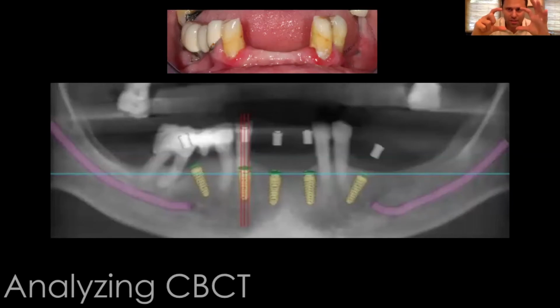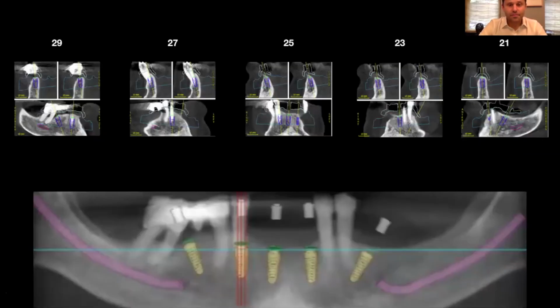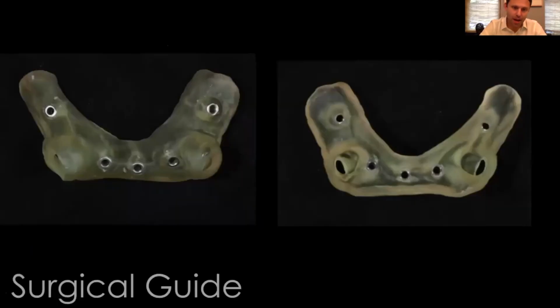If you look at this square or rectangle, the reason that we're having more AP spread here is because we're able to angle these implants at 30 degrees, then restore with multi-unit abutments, getting the restorations to go up vertical. But in this case, I need to design a surgical guide that would be tooth-borne, but at the same time not. So what did we decide to do?